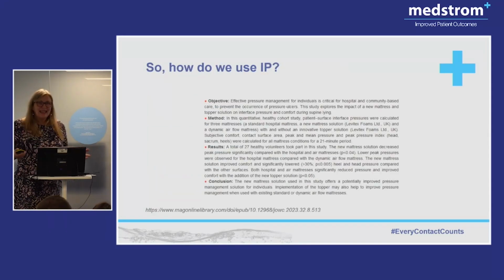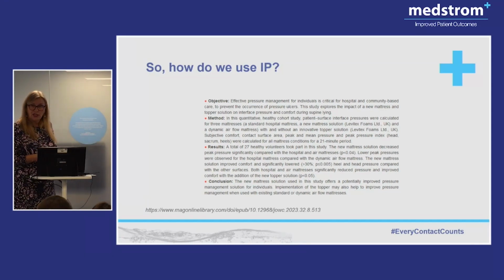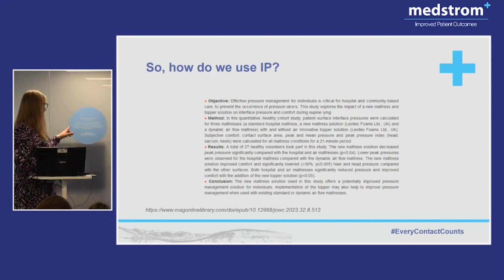So let's think a bit about what you've seen with interface pressure. This is no reflection on this study. This is a more recent study. It's from this year, and you can find it online in Journal of Wound Care, and it's by a very well-respected author. So if we look at what it says, hopefully this was done with the patients lying supine.